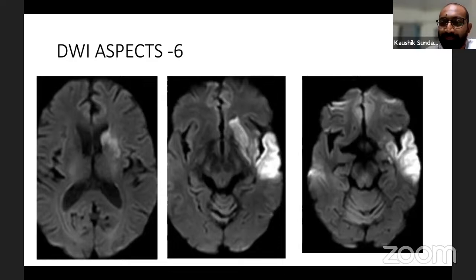Of course, one is when you retrieve the clot. Before you retrieve the clot, can you make out this difference? From CT, we can see a hyperdense sign. So if there's a hyperdense sign, then you know possibly that we are dealing with an RBC-rich clot. Correct? And so this gives you some more information. So you're processing. Imagine your mind should start working.